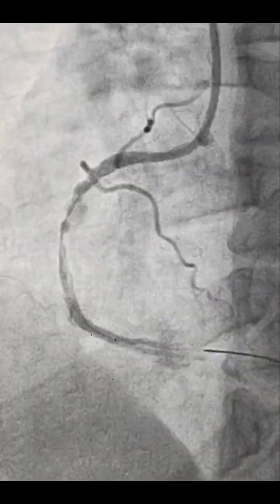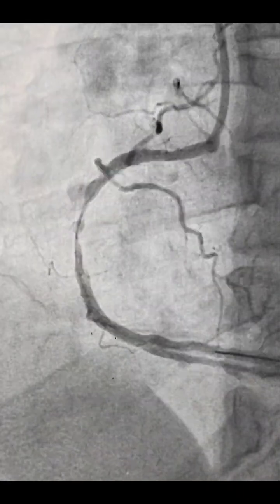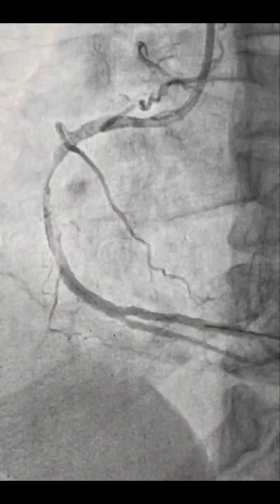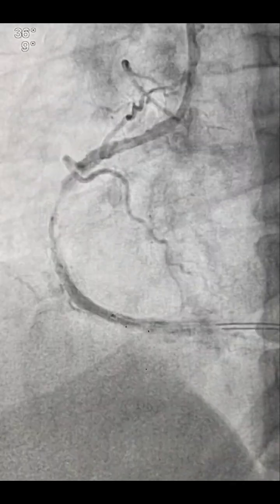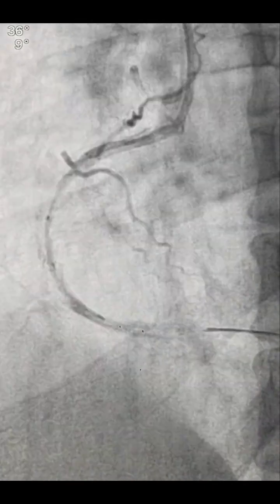This is a JR catheter with side hole, and this is a BMW PTCA wire. It was difficult to cross the lesion. Being a long lesion in the RCA, we decided to put two stents because we didn't have a stent more than 40 in length. So this was the mid RCA stent. It is 3 into 28 mm.